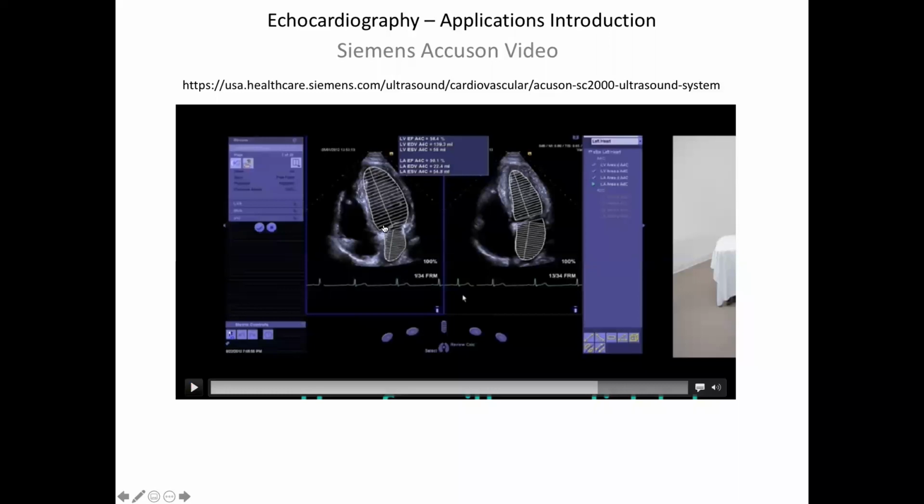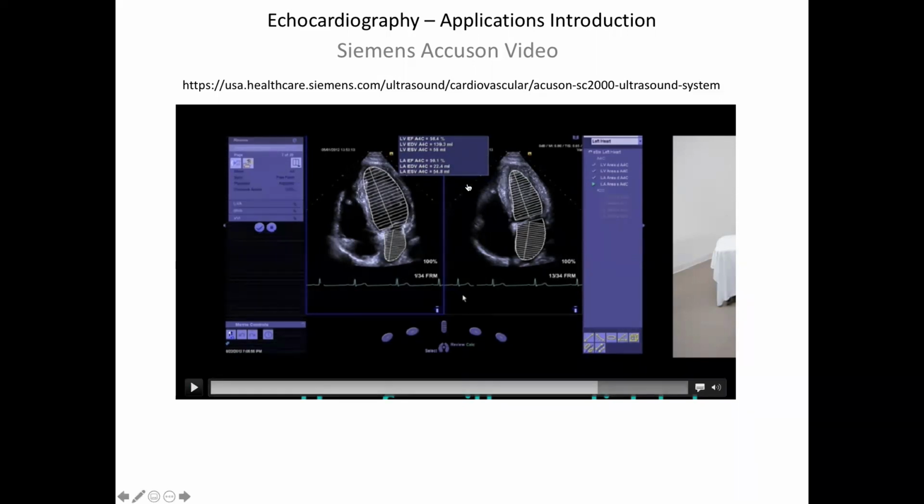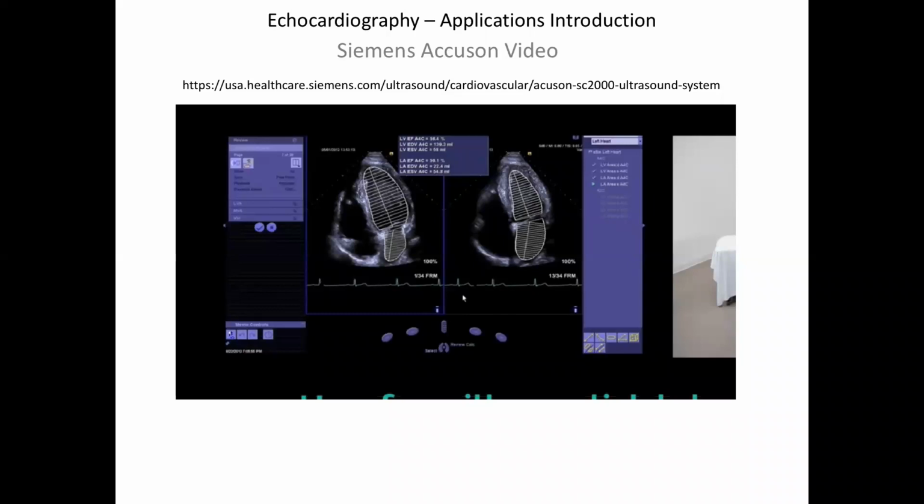Normally there's a regularization achieved by making this a smooth object in 3D. You have a number of planes that you can image, and you can look at the heart at end diastole and systole and compute performance by ejection fraction and things like that, and change of volume in time. So that first derivative of how the volume is changing in time, etc.